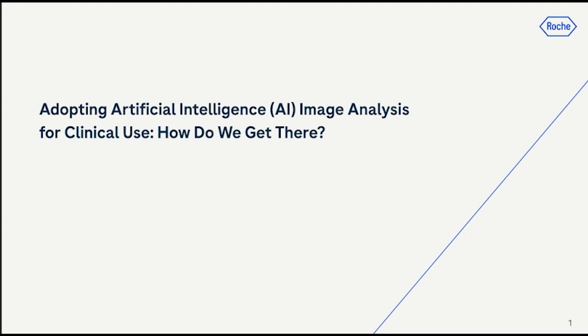Yes. So this is the topic that the Digital Pathology Association really cares about, because currently most of the algorithms approved by the FDA are all locked down. However, there may be changes in certain parameters. So currently the rule of thumb is if it's a minor change, you document it and submit it. But if it's a major change, and it depends on how major that is, the regulatory pathway is very different. So this is from the industry side.